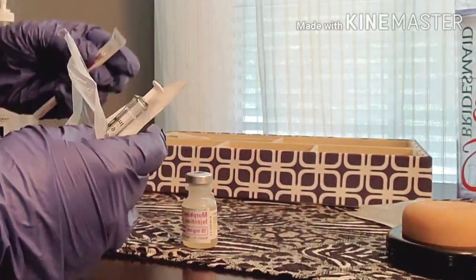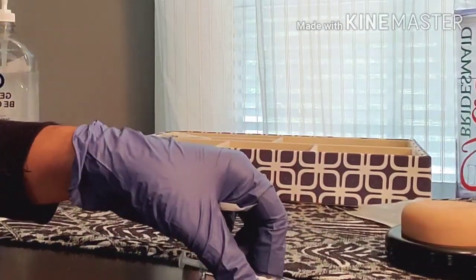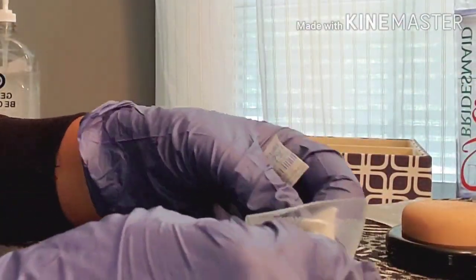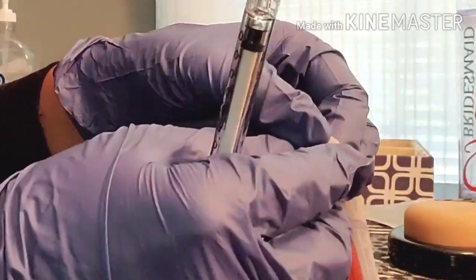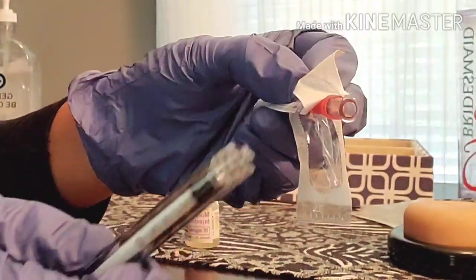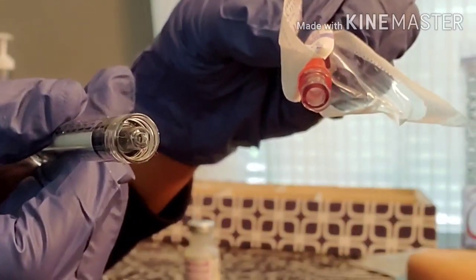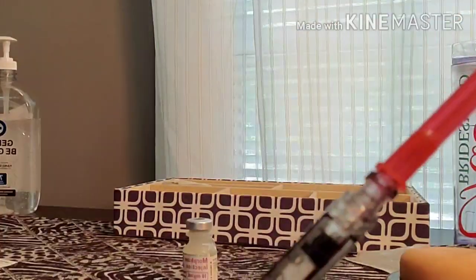Next, I attach my syringe and needle. A big pet peeve: don't place your syringe and needle on the computer station or table — you've just exposed them to whatever microbials are there. Take your syringe out by simply pulling it apart, open your needle, and note that the luer lock is on the side you opened so you don't have to turn anything. Needleless systems were created because healthcare workers were getting stuck with needles, so we must use proper needle safety.